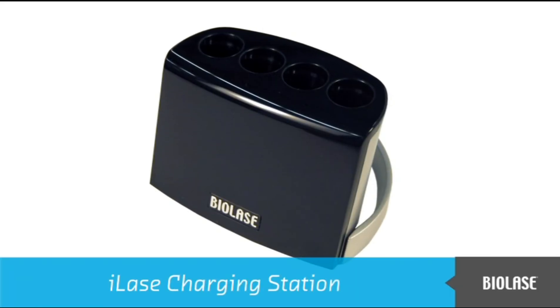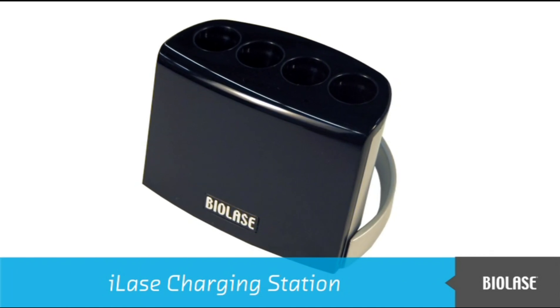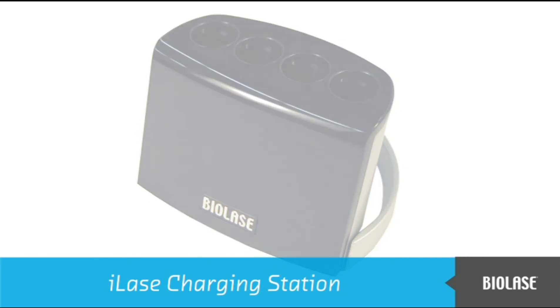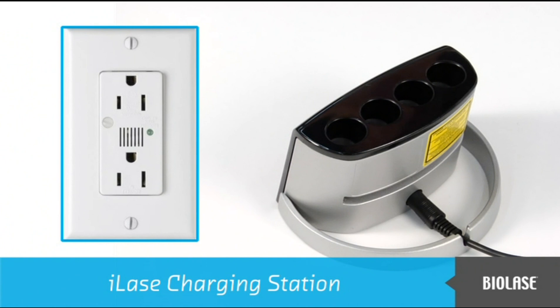Before using the iLaze, we should set up the charging station and charge the batteries. Place the charging station on a surface where it will not be disturbed or come in contact with liquids or contaminants. Then insert the power plug into the back of the charging station, and insert the other end into an AC power outlet.